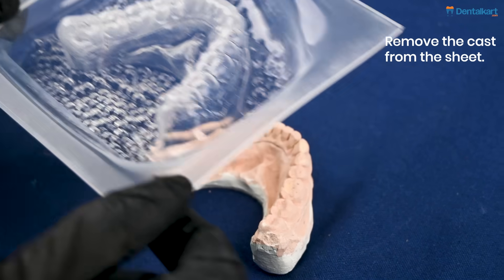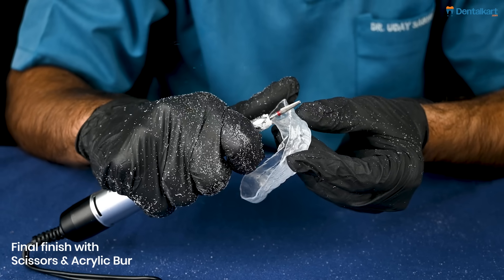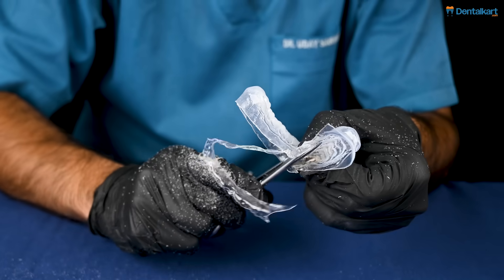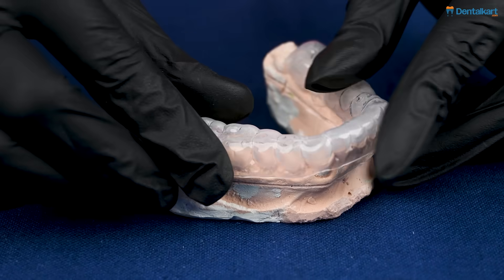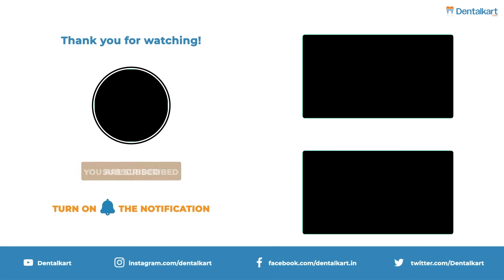And then you are ready to begin with the finishing and polishing of your sheet. You can use scissors at this point, or an acrylic trimming board to get the final finishing.